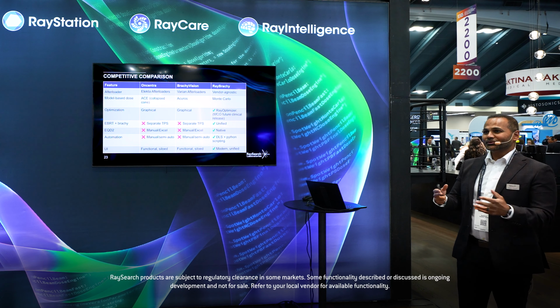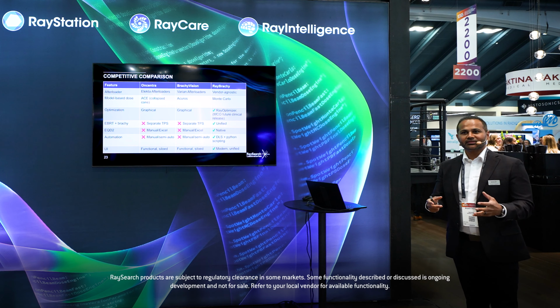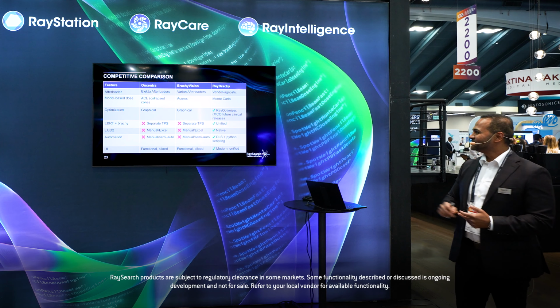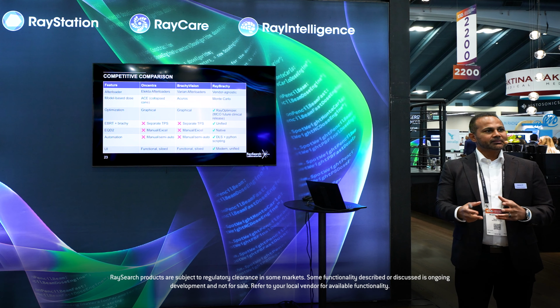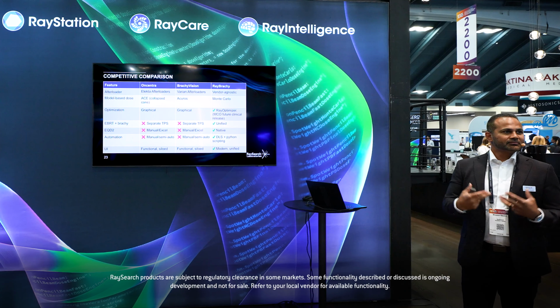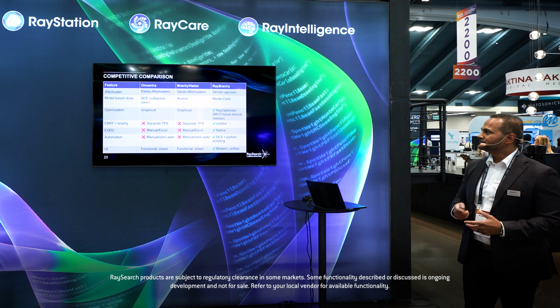Automation, you know, semi-automatic, manual processes. In RayStation, you have access to deep learning segmentation. That's part of the application itself, and then Python scripting, of course, that's part of the base with RayStation. And then the UI, like I talked about, mature products. However, they're limited by being siloed, right? They're not integrated into the TPS like we are. So what we think with RayBrachy, we're a modern application, and that's unified. That gives you all of the ability to have the advanced tools that a TPS does.